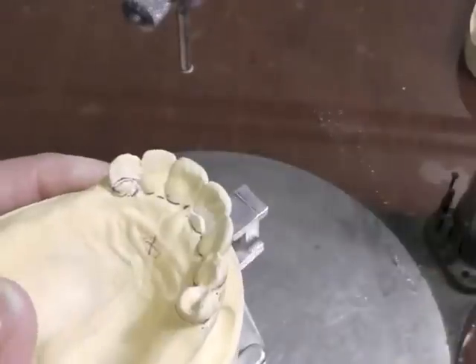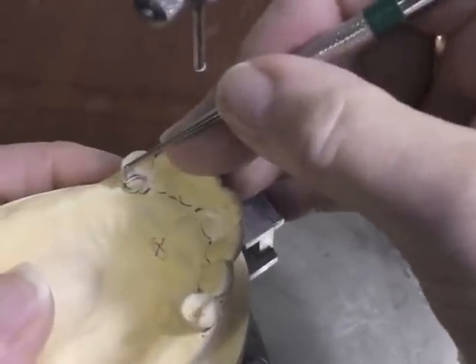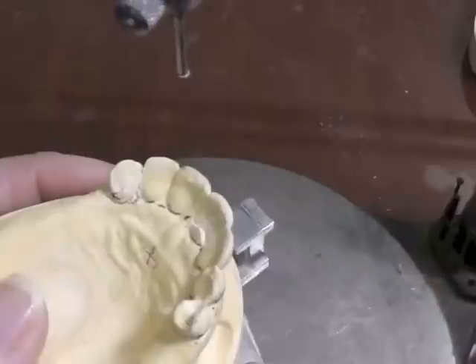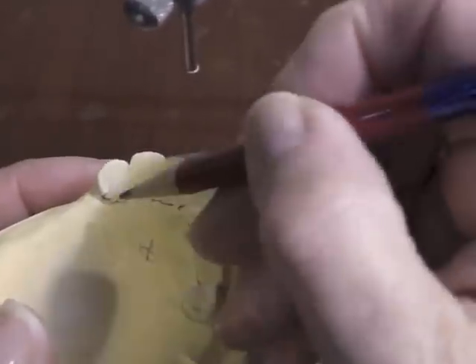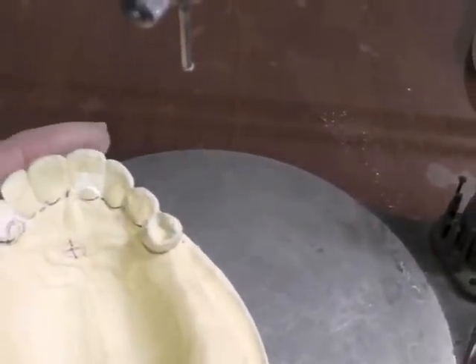I can almost tell I still have a little undercut — I wouldn't be able to do that otherwise — so I still have a little bit of undercut to remove up above it. I want my chevron shape to rest right here at the junction of the middle and cervical third.